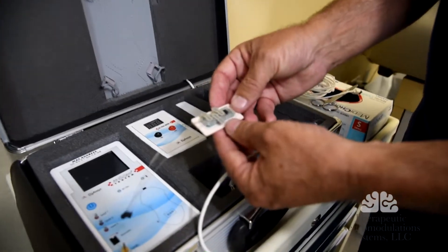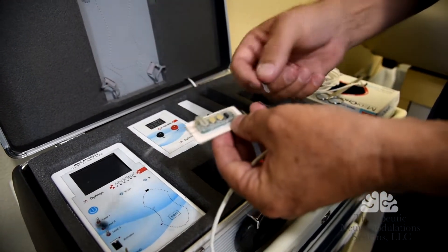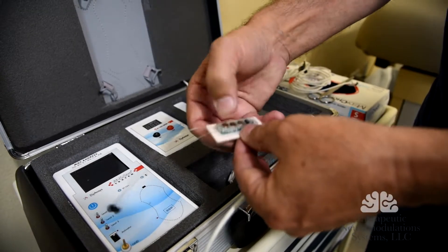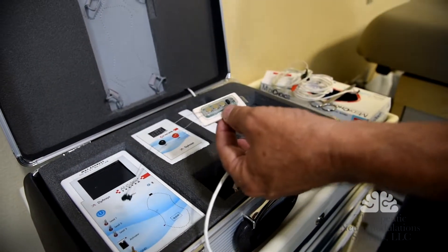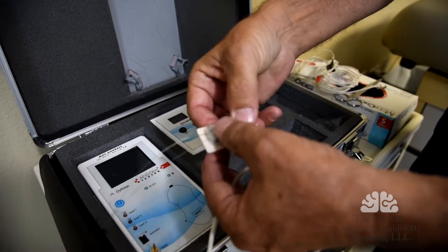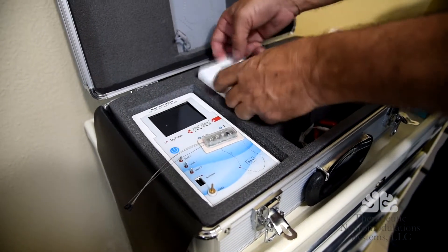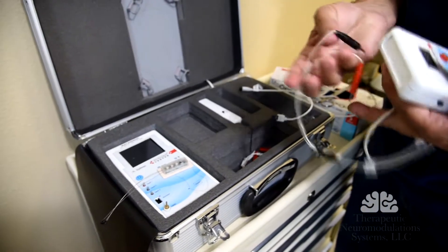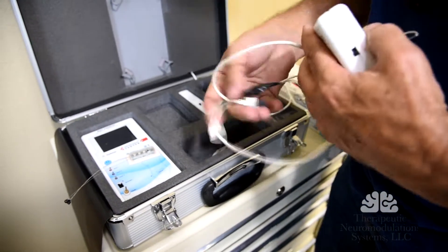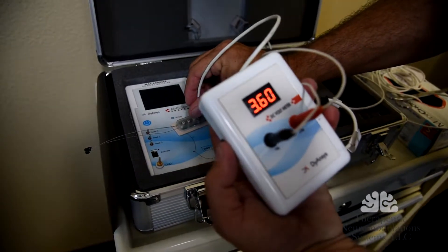So here's the device. First thing we do is pull the tabs on the device, then we're going to push the batteries in to activate the device. This is the top — we're going to push it, and this is what activates the device. I'm going to check to see our volts and see if we have juice, voltage. We have it activated.